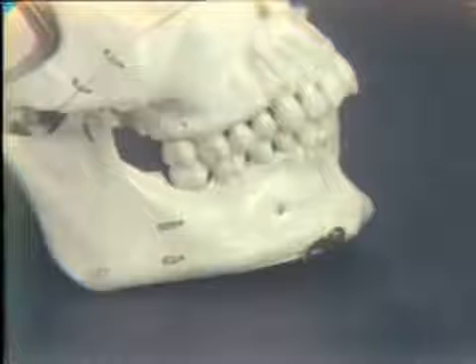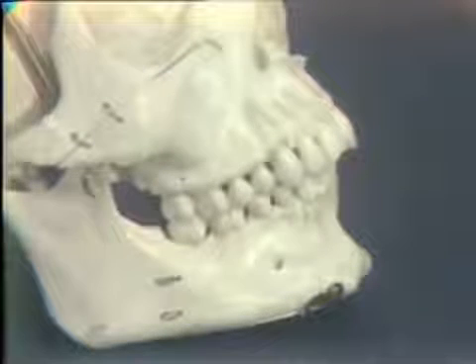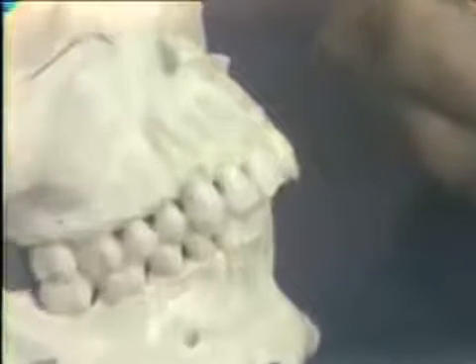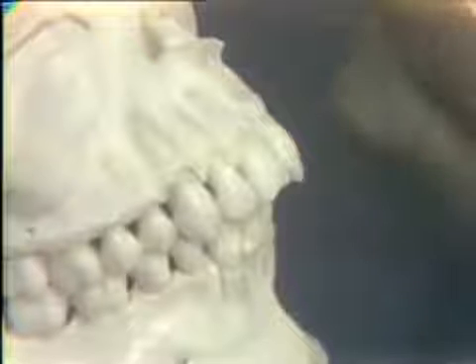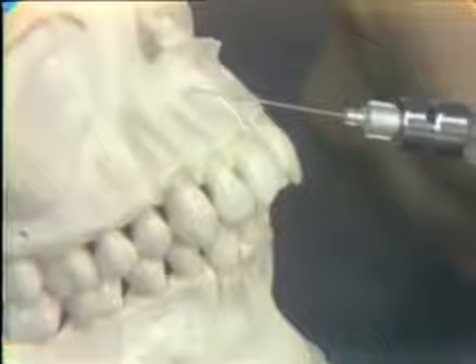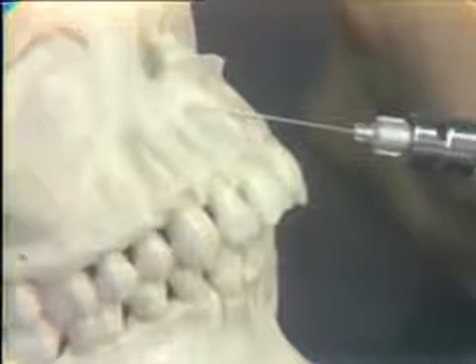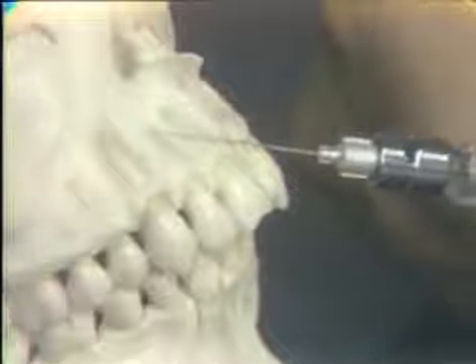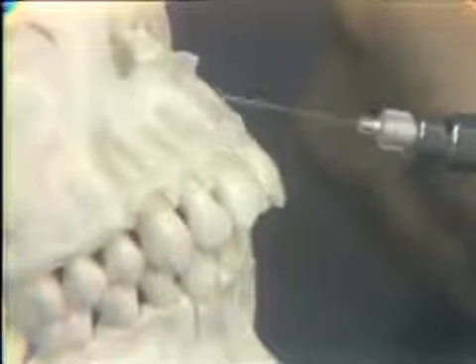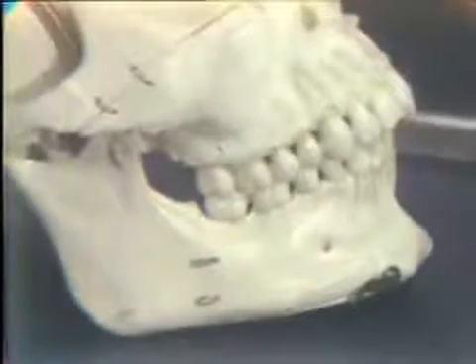To anesthetize the incisor teeth, again, same technique, labial infiltration, with the mouth half closed, lip retracted anteriorly. Needle bevel can be carried in through the vestibular tissues and quickly against bone at a level of or above the apices of the roots of either the central or the lateral incisor tooth, depending upon the tooth you're going to carry out the instrumentation upon. All right, let's again show it on the patient.